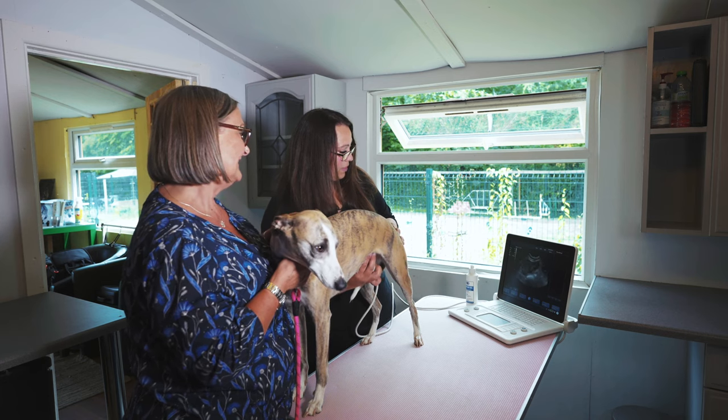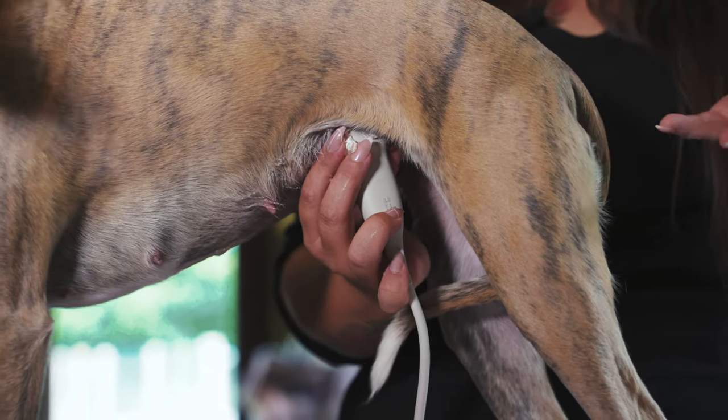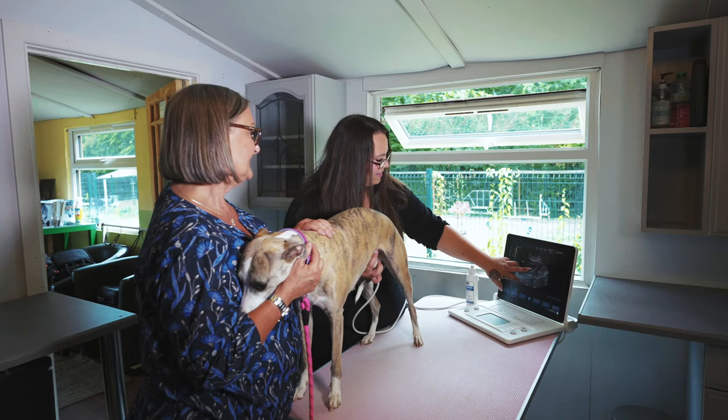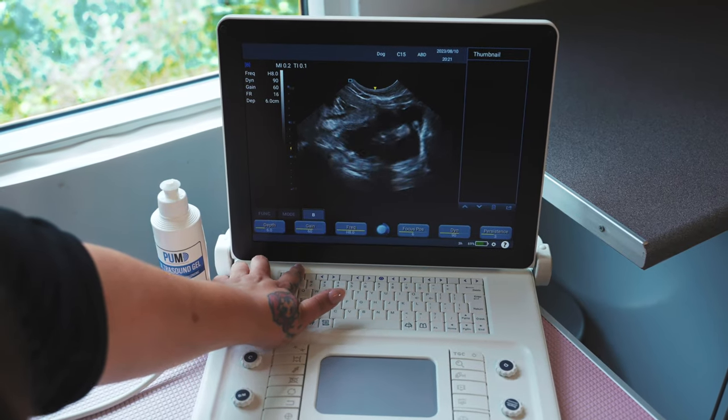We've got another one there, so we've got at least two, which is nice. As I mentioned, if you get a singleton it can be a little bit of a worry whether they can pass quite a large puppy when there's just one. And you can see the heartbeat there — yes, that's the heart.